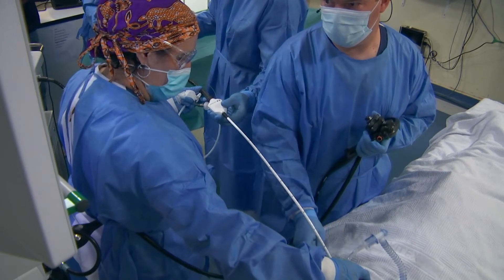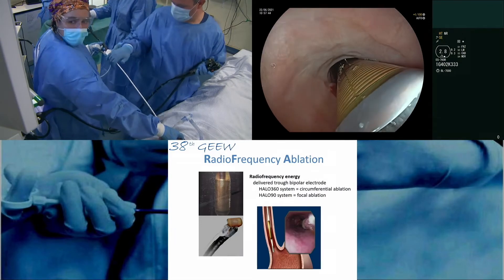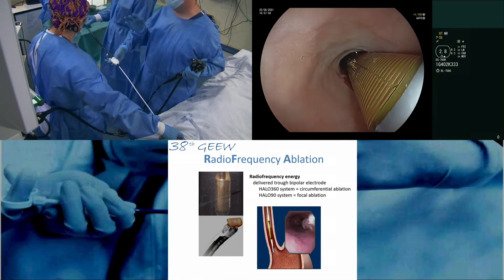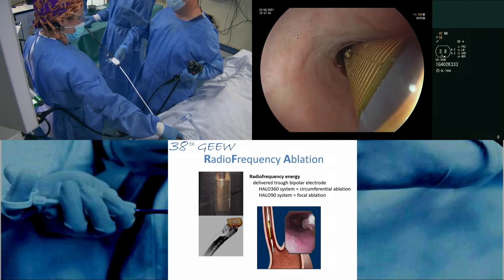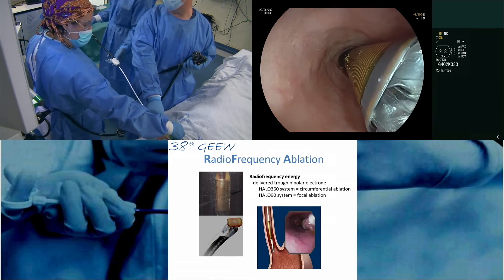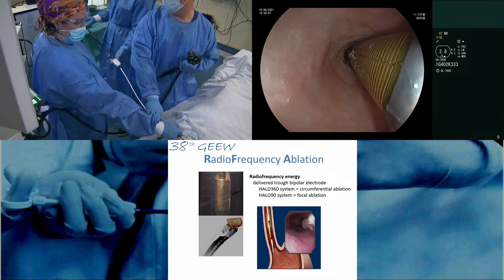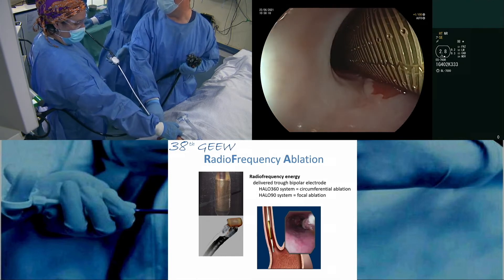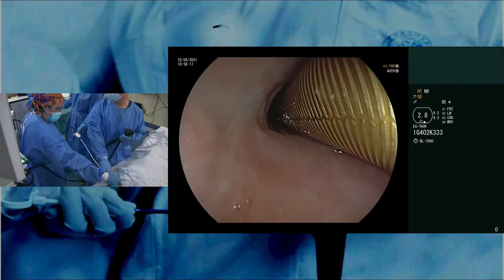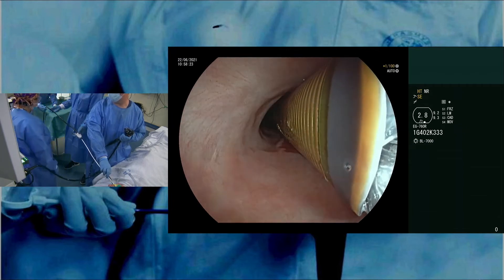Raf is introducing the scope to be aligned with the catheter. One thing to remember, Pierre — when we have a stricture, sometimes you will have a skipped area and we need to accept that. We will try to ablate everything, so we start a little bit more proximal. You need to identify the area of ablation — there's a plastic part here which doesn't ablate, and then you see clearly the electrodes, which is the ablation part. Usually we try to ablate one centimeter proximal and see what happens.